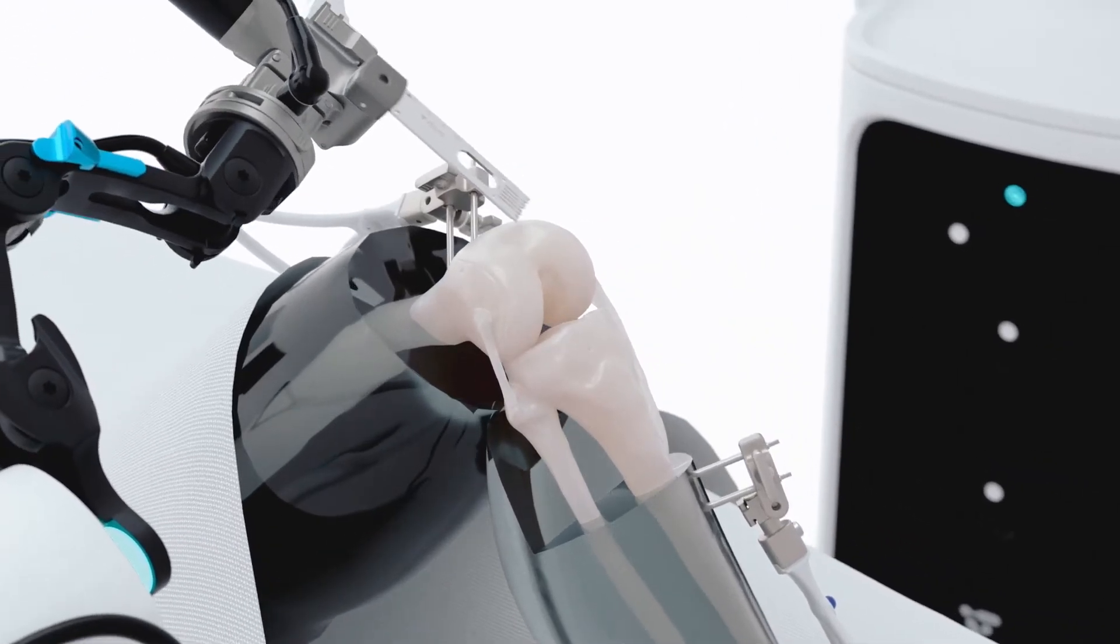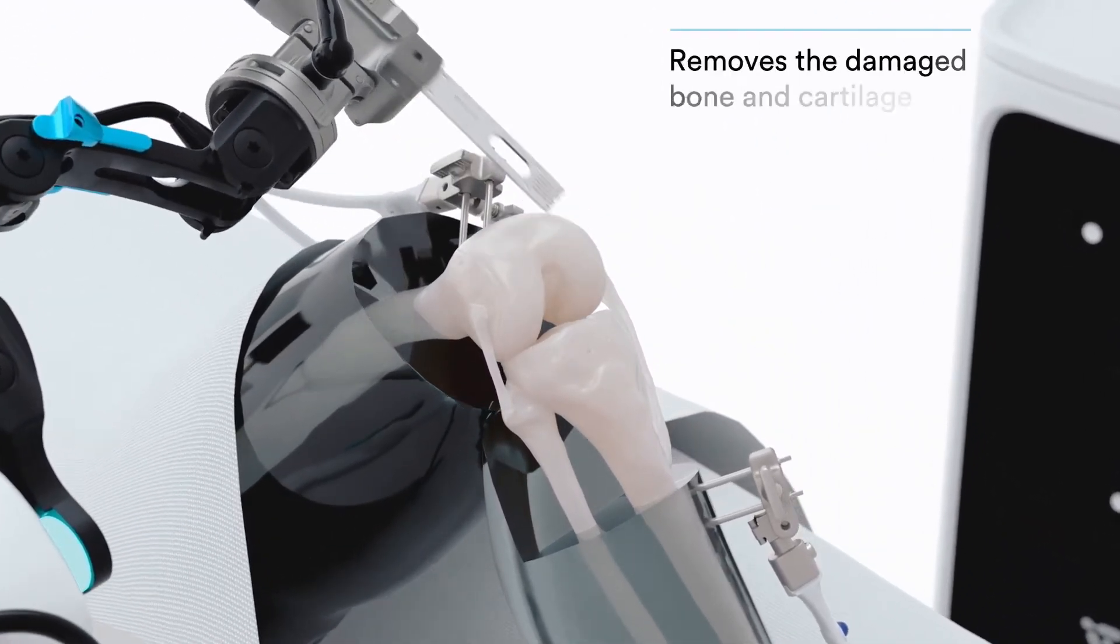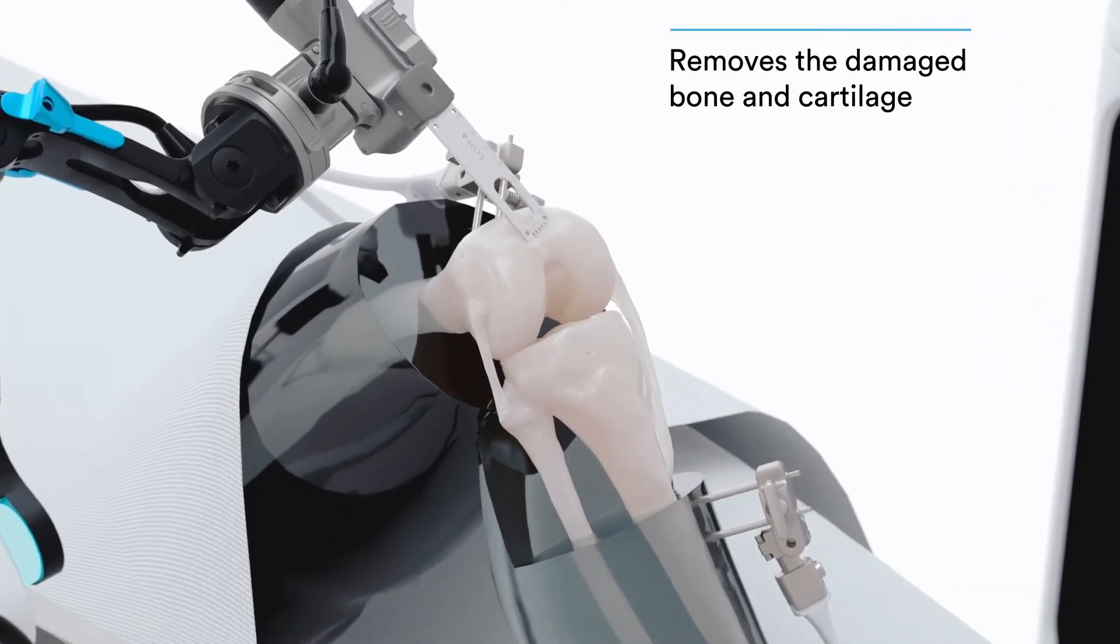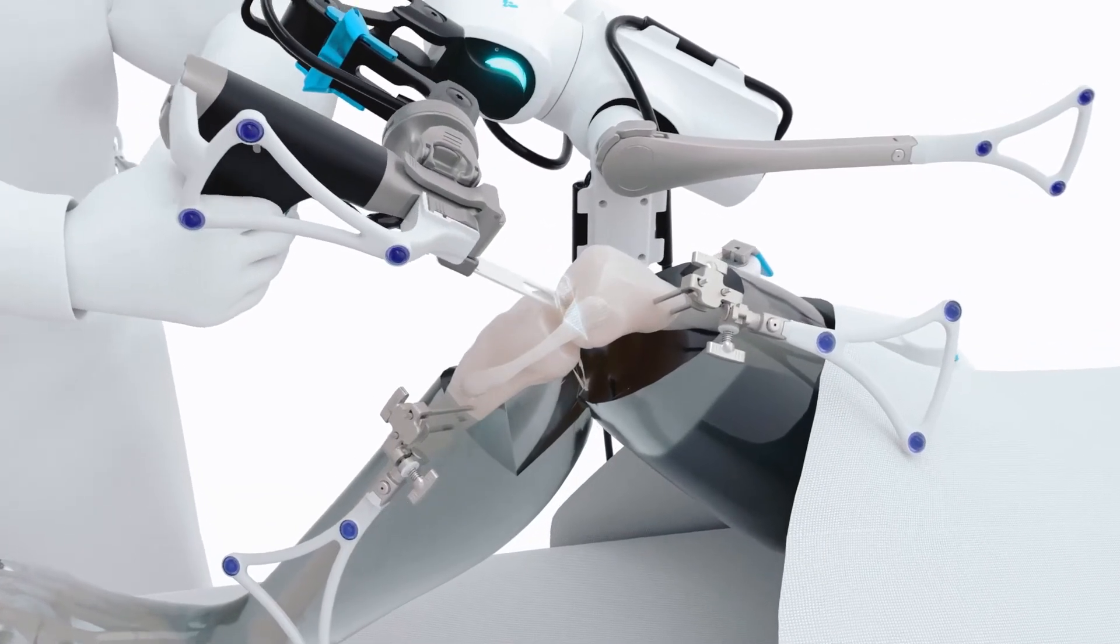To restore your knee, the surgeon guides the robotic device to remove the damaged bone and cartilage in your knee, making sure it matches the surgical plan.